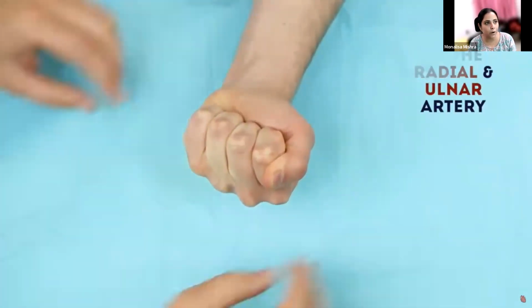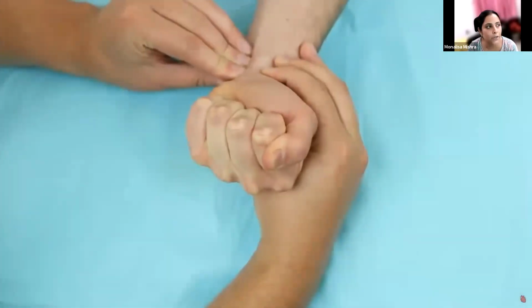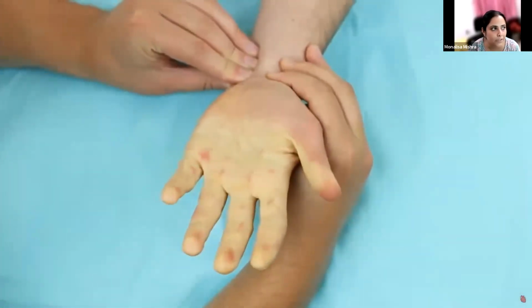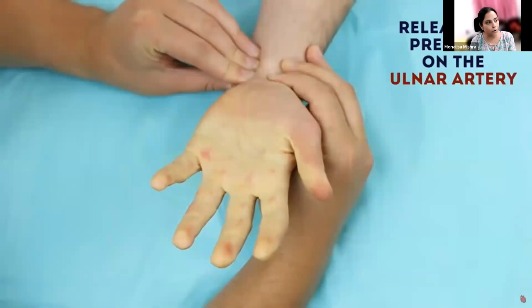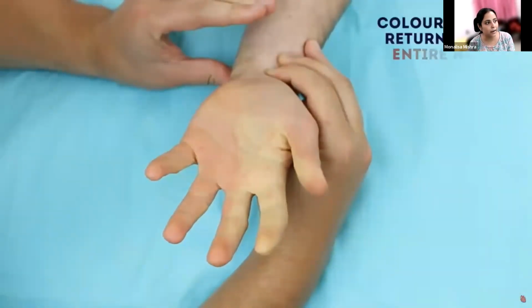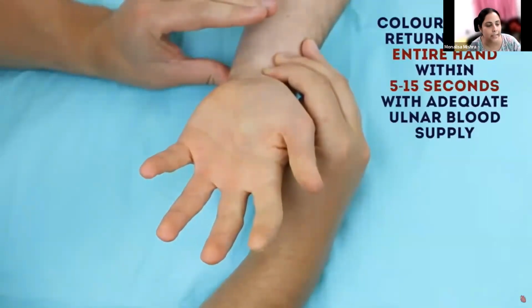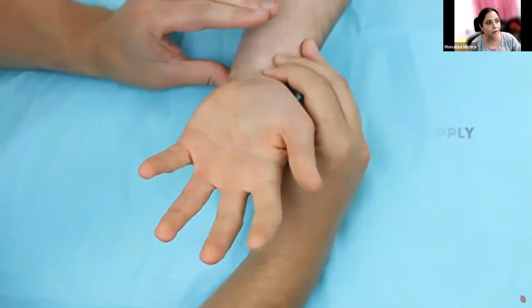After that, you apply pressure to both the radial and ulnar arteries. As you can see in the video, the person is applying pressure to both radial and ulnar arteries. And now you see that the hand has become white. When you release the pressure on the ulnar artery, you see the color returning to the hand in 5 to 15 seconds with adequate ulnar blood supply.